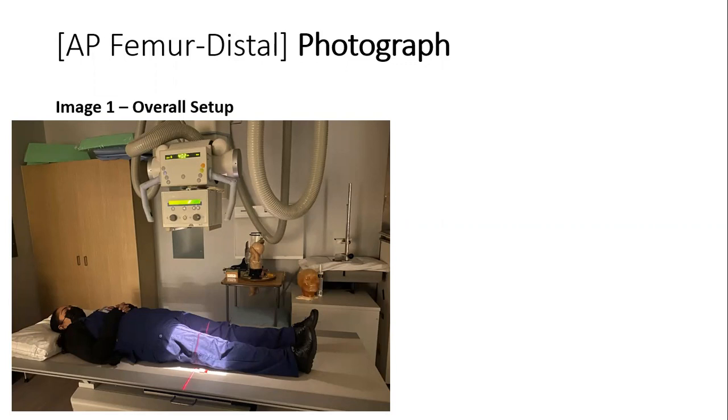We will need to go out into the lobby, find our patients, introduce ourselves, and let them know that we are going to take their images today. We shall bring them to the back and ask the patient to give us their full name, date of birth, and last menstrual period if needed.